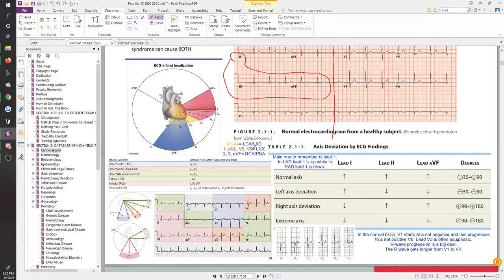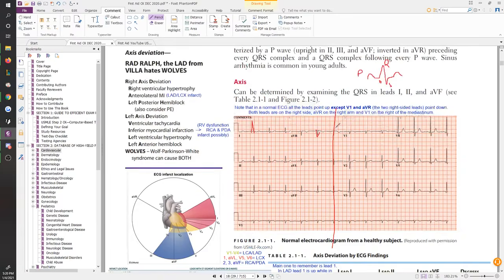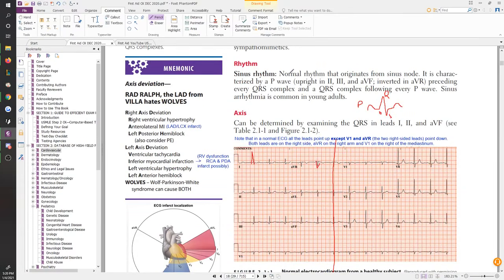And what happens is that the placement of these leads, as I was saying in the beginning, so make sure you check out a video of the placement of these leads, is partly the reason why a lot of these lines either go up or they go down, right? So here they just told you that you're going to look for a P wave that is upright in 2, 3, and AVF, right? You're seeing it. It's all there. You don't have a P wave that's going down. It's not a very prominent P wave, but they are there, and they are pointing up.